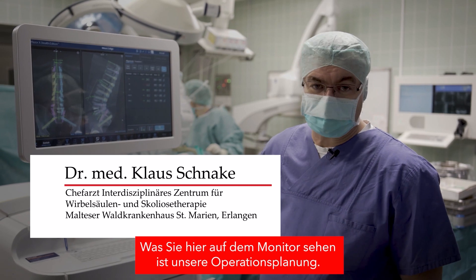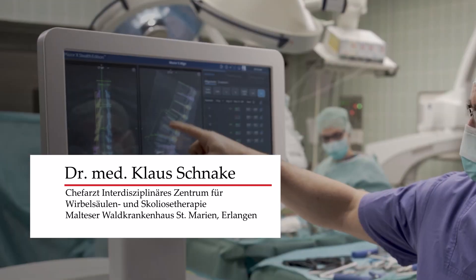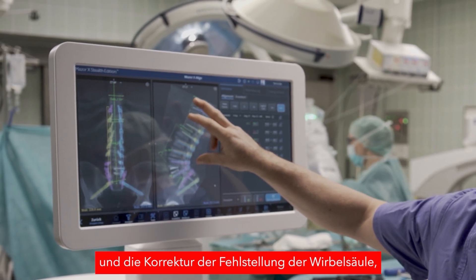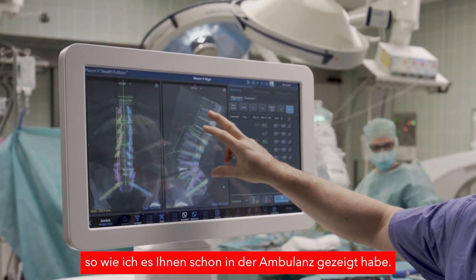What you can see here now is our planning — our pre-operative planning. Our goal is to achieve a proper lordosis and to correct the sagittal balance as I showed you in the outpatient department.